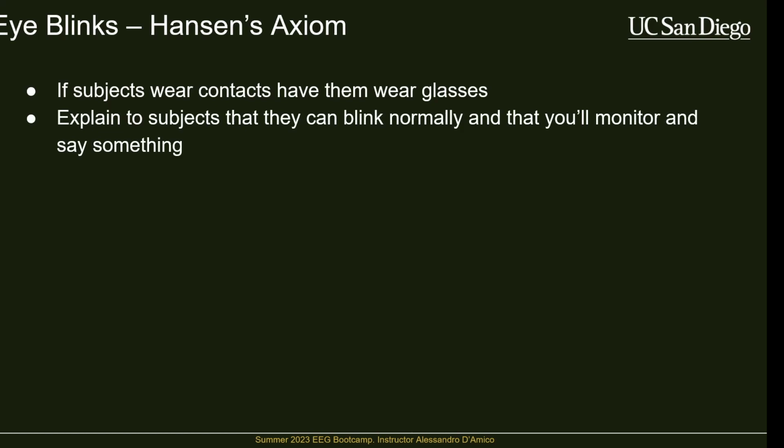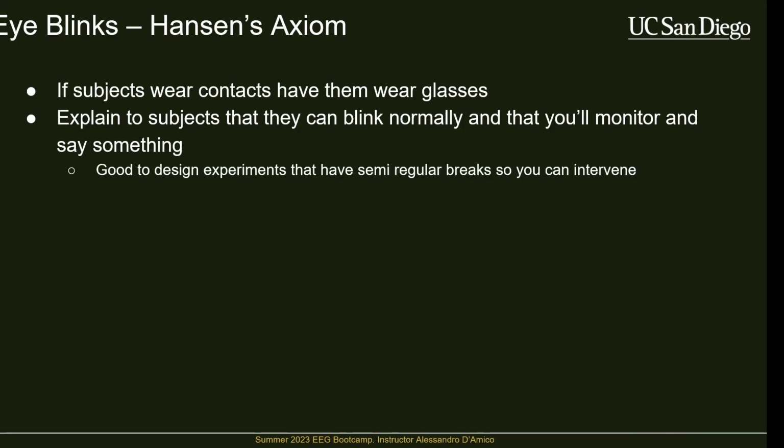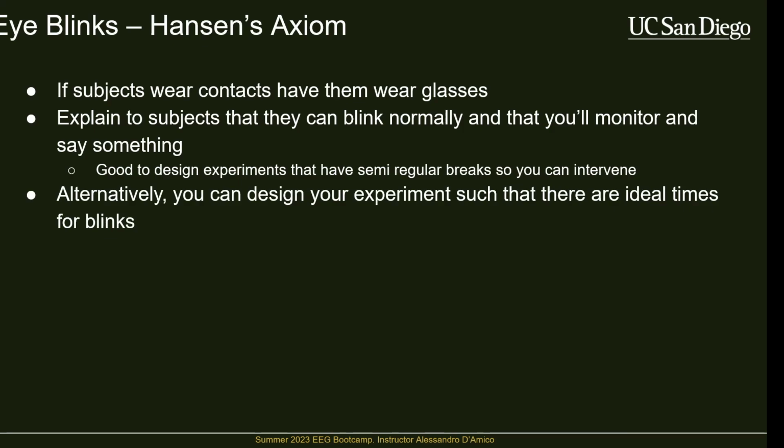You can explain to the subject that they can blink normally and that the experimenter will tell them to stop blinking only if they recognize that they're blinking too much, which is what we're going to do tomorrow. It's also good to design experiments that have a lot of breaks, because if somebody is focused, trying not to blink for long periods of time, they're more likely to start blinking or moving or making even larger facial movements. So design experiments that have blocks that are relatively short and have lots of breaks so that people can move around and blink.